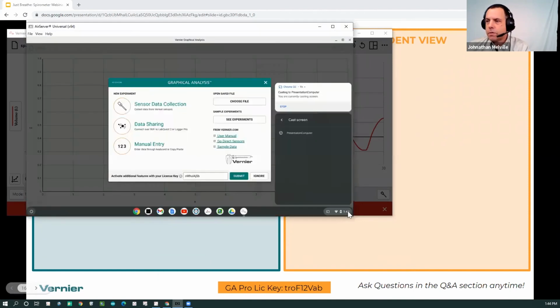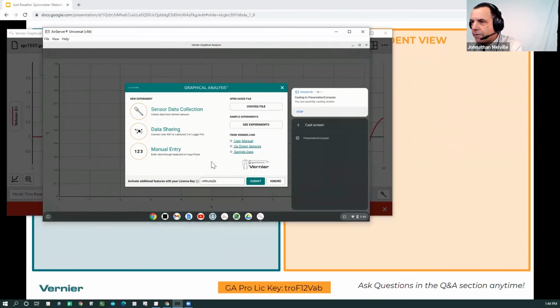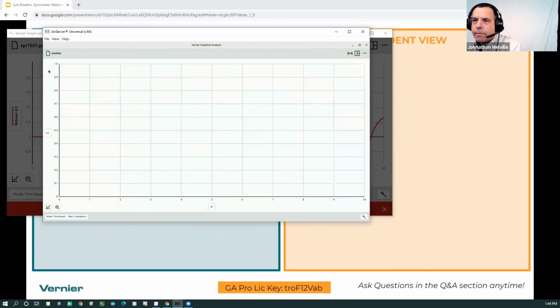So the students, let me move the Chromebook over. Now I'm a student here, and I have a Chromebook. I'm just going to launch GA Pro. I'm going to start off with new experiment.